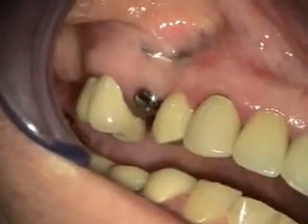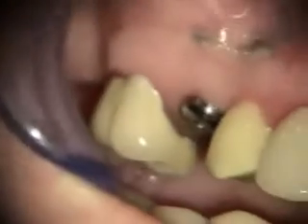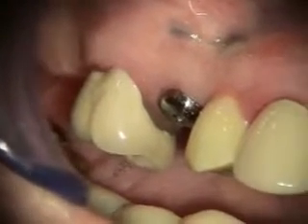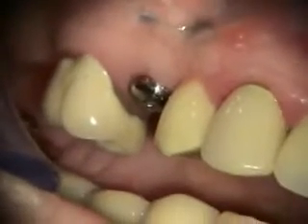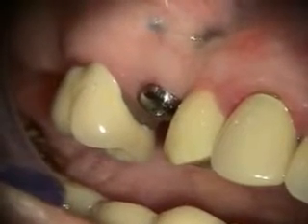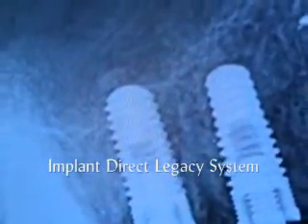That's a two-week post-op of the implant in the number four site. A little closer view — we had taken out number four and grafted that socket. In the pontic site, we had placed an implant in the number five area with an immediate provisional. In about a month she's going to be ready to restore the implant in the number four site. Here's our x-ray — you can kind of see where we pushed the sinus up a little bit.